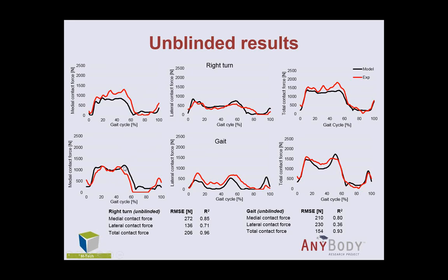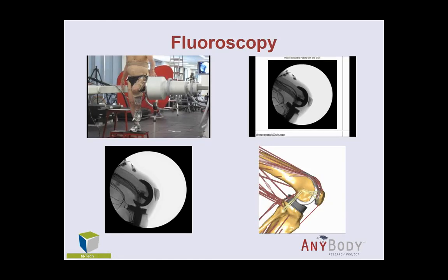There's a little bit here around toe off again, where the estimated force is kind of delayed compared to the measured force, but amplitude-wise it looks okay. The lateral contact force is underpredicted all the way. It has all the right peaks, but it is slightly underpredicted all the way. But I think in general, for something that is a biological system, this is actually very good.